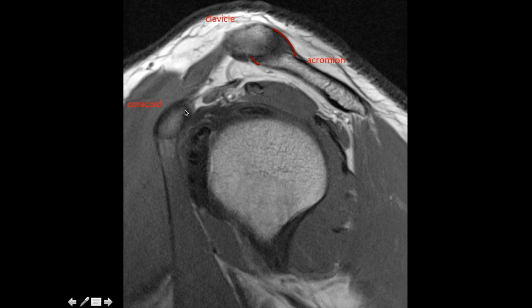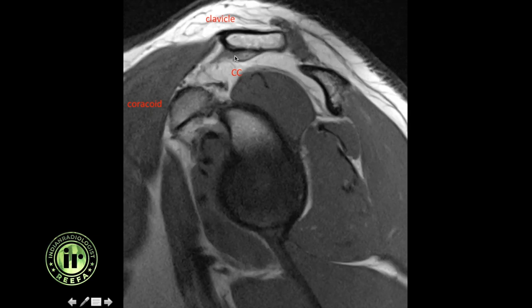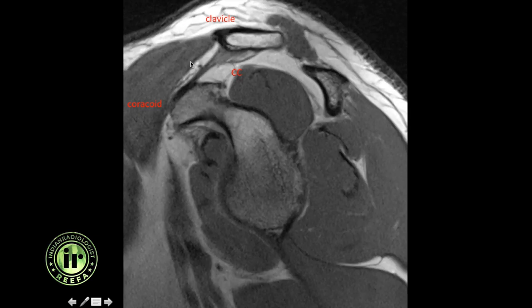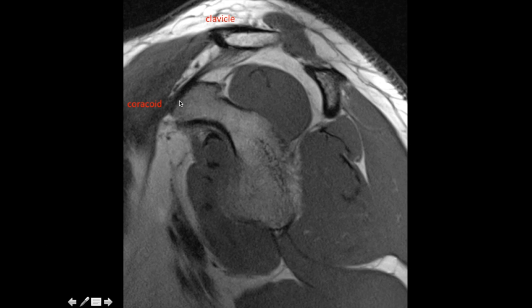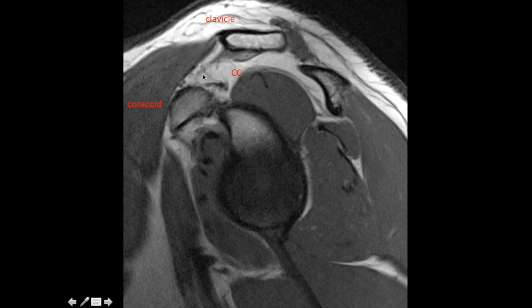Also visible is the coracoid process with the short head of biceps tendon attaching to it. Going further medially you see the coracoclavicular ligament — a ligament arising from the undersurface of the clavicle and attaching to the coracoid process. Do not confuse the coracoacromial ligament with the coracoclavicular ligament; it is the coracoclavicular ligament that is critically important for the AC joint.